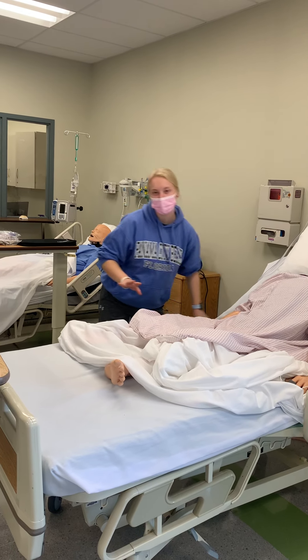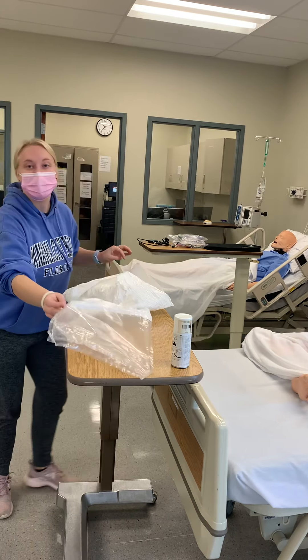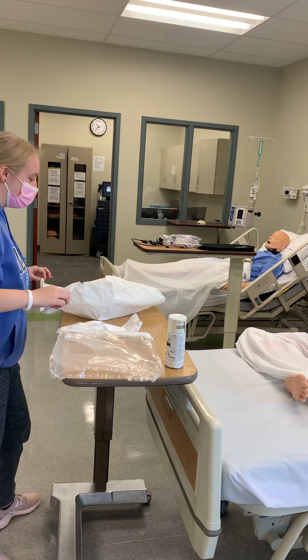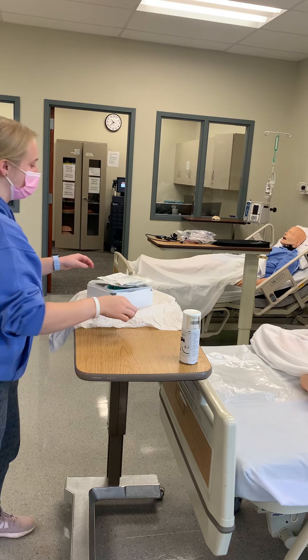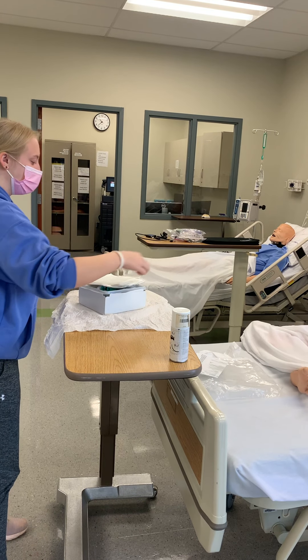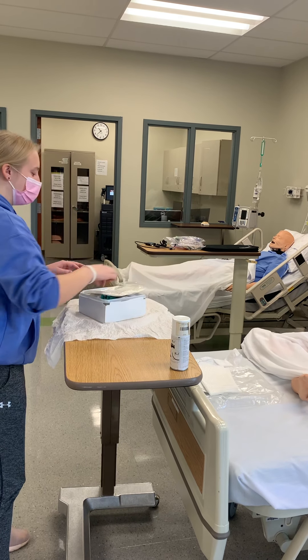Okay. I'll leave it down. Now this was in the bag, but for today's purpose. I'm going to put this on here to be my trash area. Okay. I'm going to move those right now.